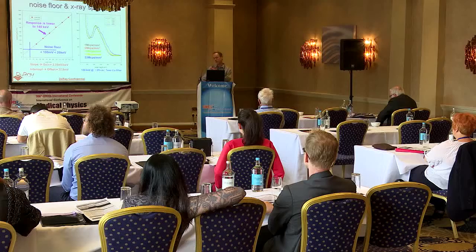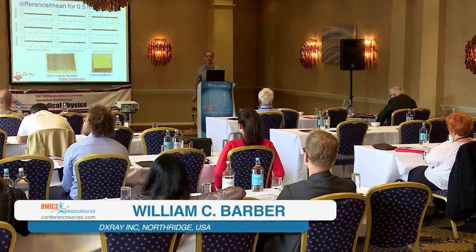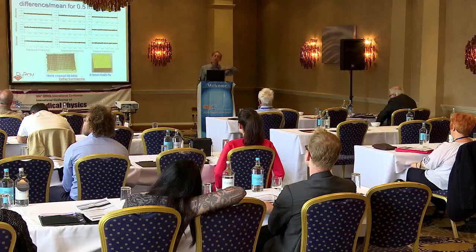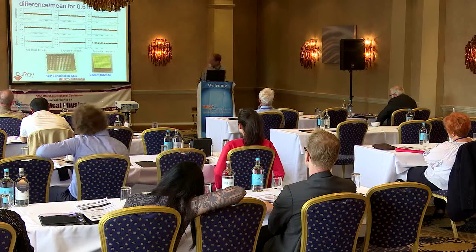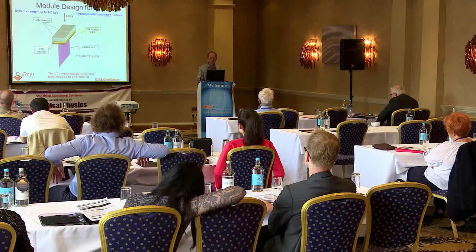But this shows that the device can be used well, at least up to 17 million counts per second per square millimeter. Here is a difference versus mean for the stability, which is one of the most important parameters in a detector for CT. And we see no variance in the output outside of statistics.